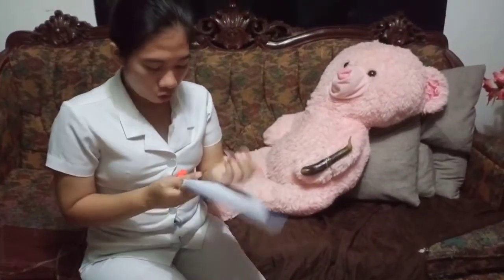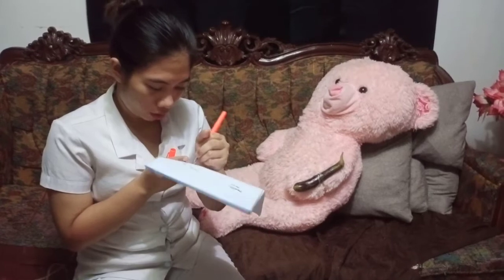And then document if the client had a positive or negative skin test result, and follow the agency protocol on labeling of allergy to the patient. So, the patient has no allergy.